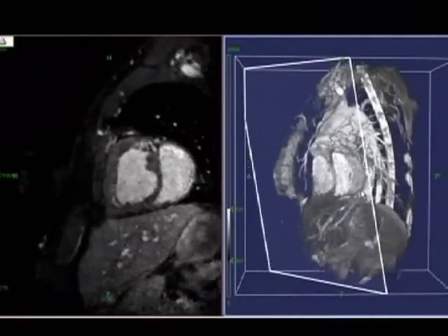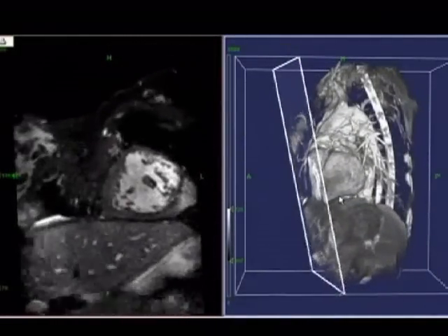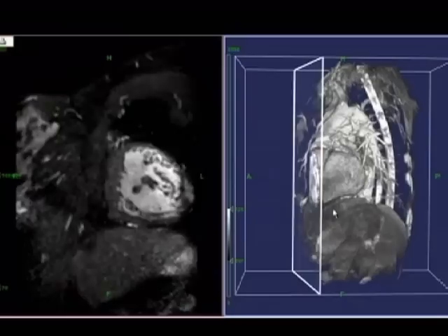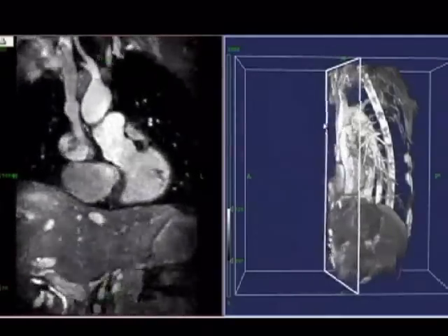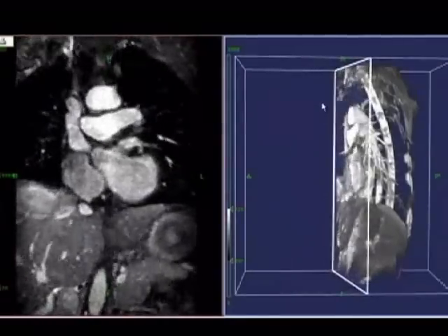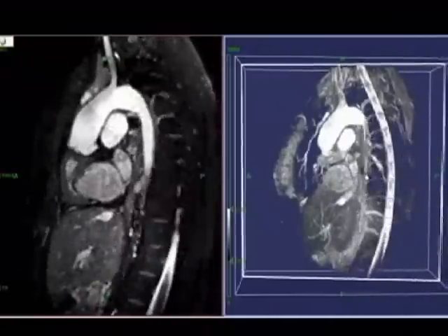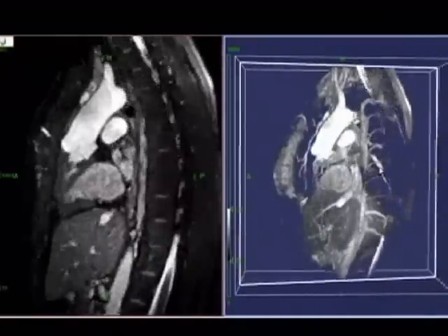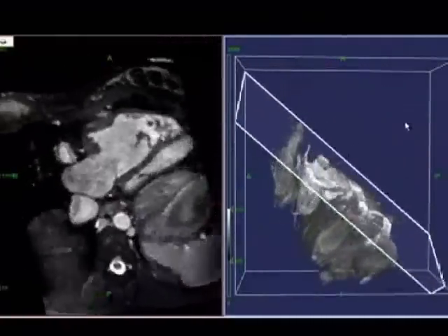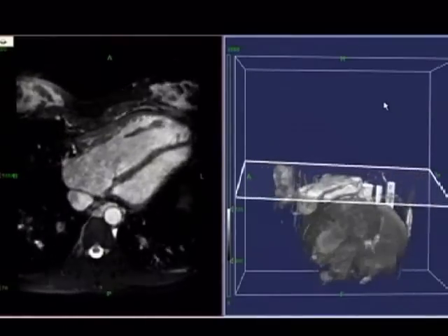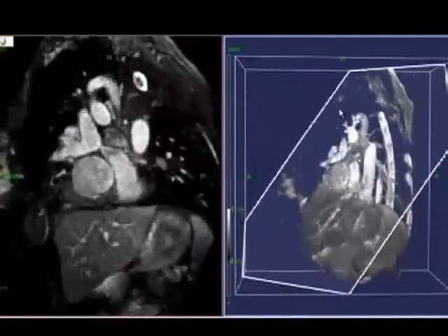On the right we see a volume rendering of the heart recorded at late diastole. On the left, individual slices from this dataset are reformatted interactively. Guided by the volume rendering, the reformatted slices can be obtained from any angle at any position. From these slices, a morphological diagnosis can be obtained.